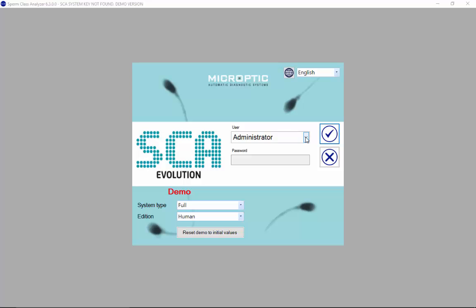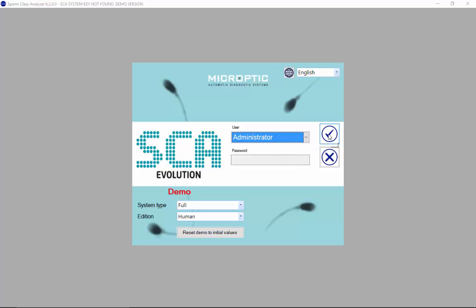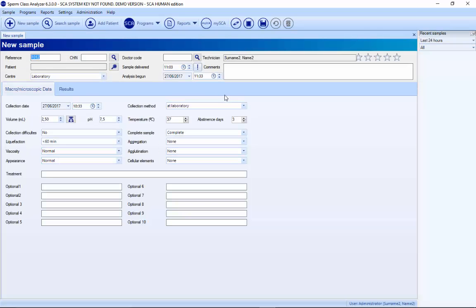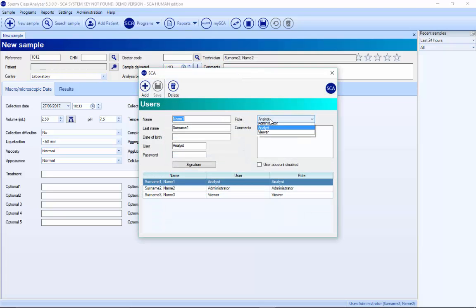First of all, you have to select the user. It's possible to have different users depending on what you want to do in the system. If we select the administrator, the administrator can do everything. We can edit the administrator and change the different roles — all these roles are possible to customize. Also in this new version, we added a user account disabled option. If you press it, this user will not be shown in the main window.